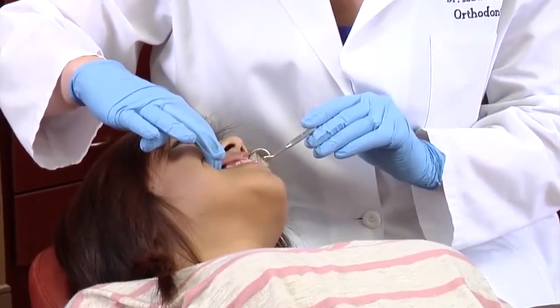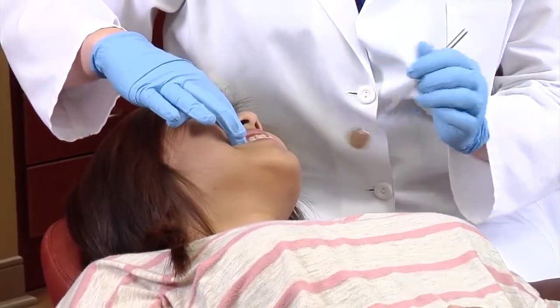Some patients have their TAD in for only a portion of their treatment, with as little as 6 months, while for others, they have them in for the duration of their orthodontic care. When TADs are required for longer treatment periods, their positions may need to be changed. When the treatment is complete, commonly TADs can be removed with no anesthesia or with a topical numbing cream.